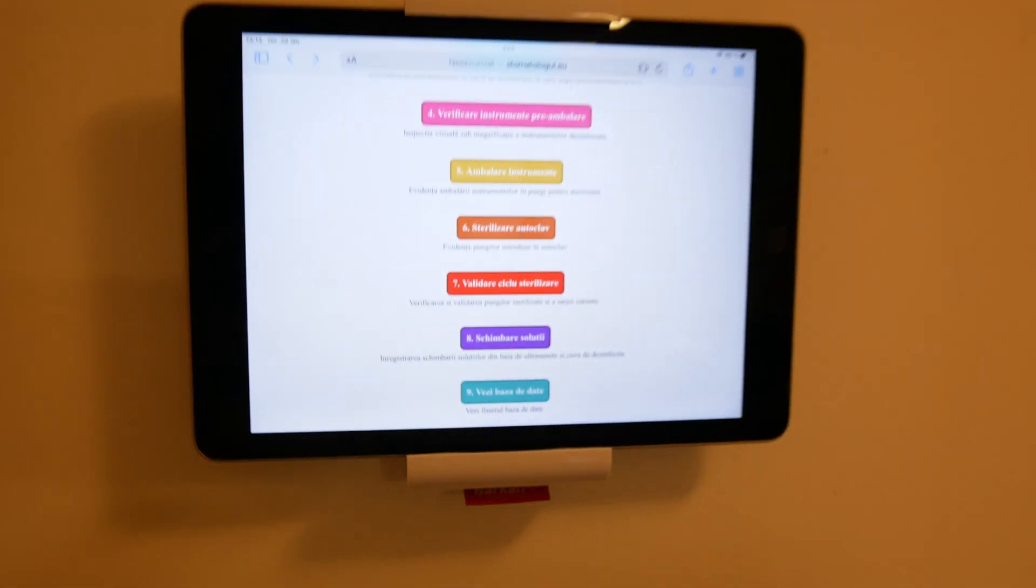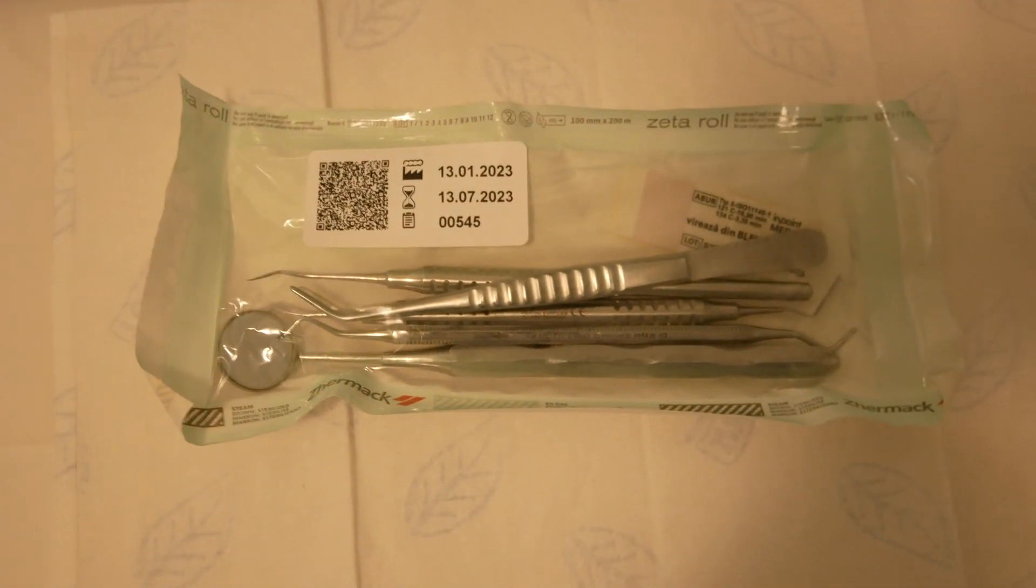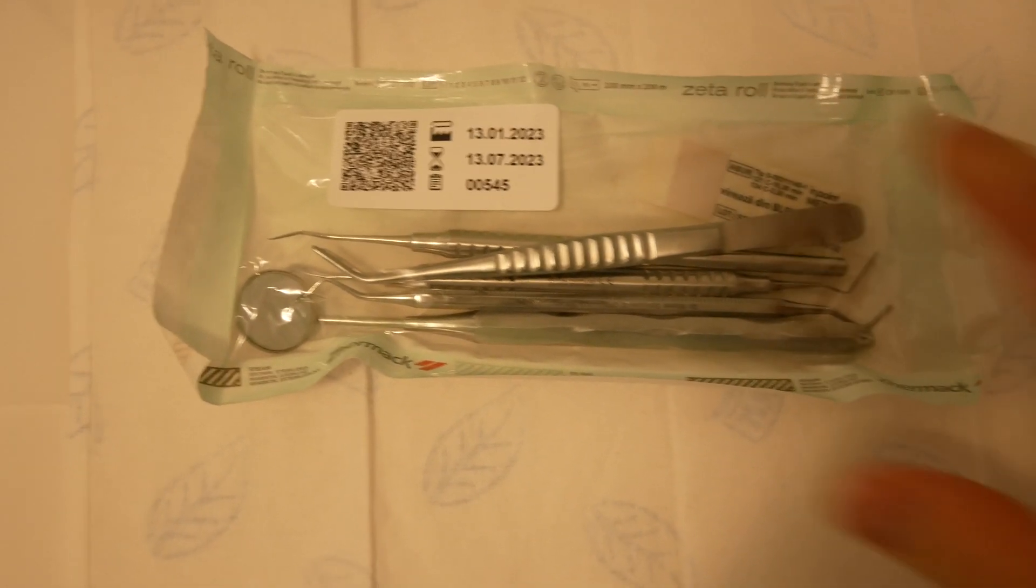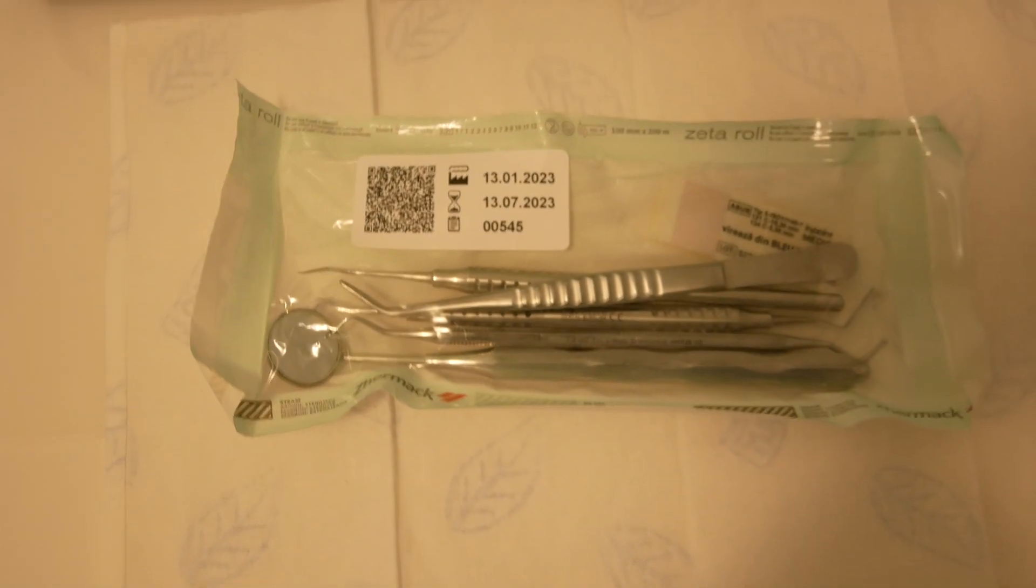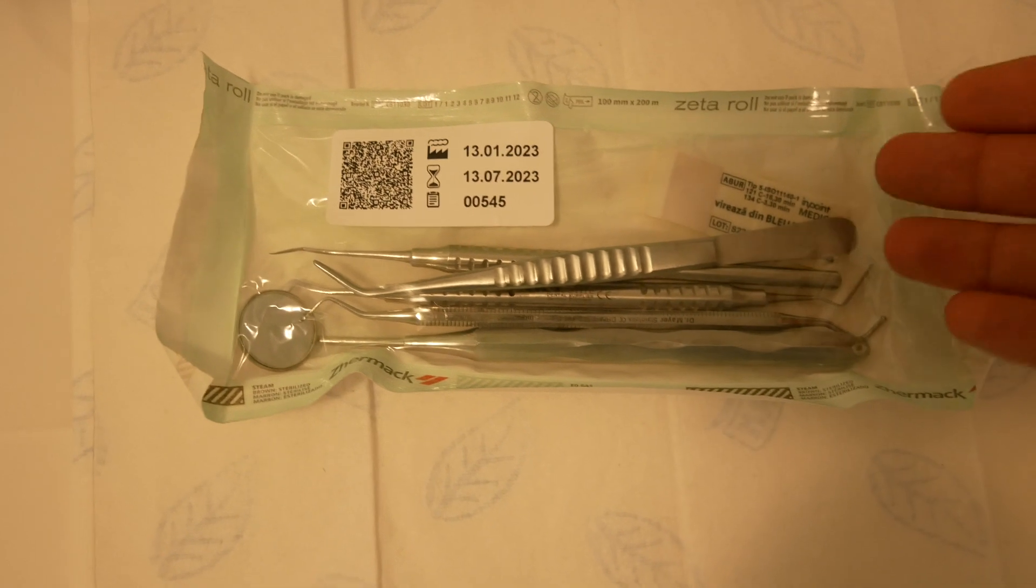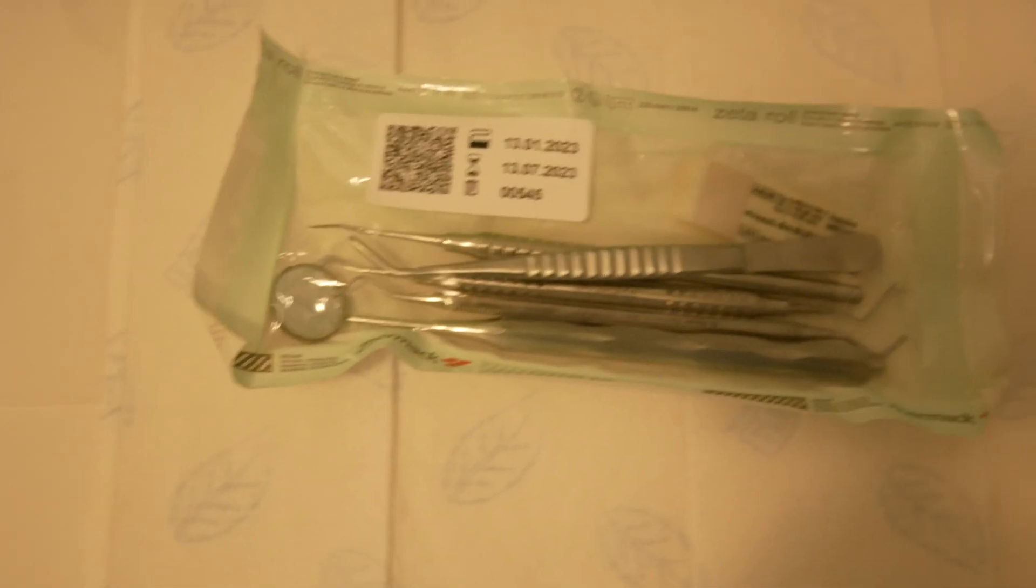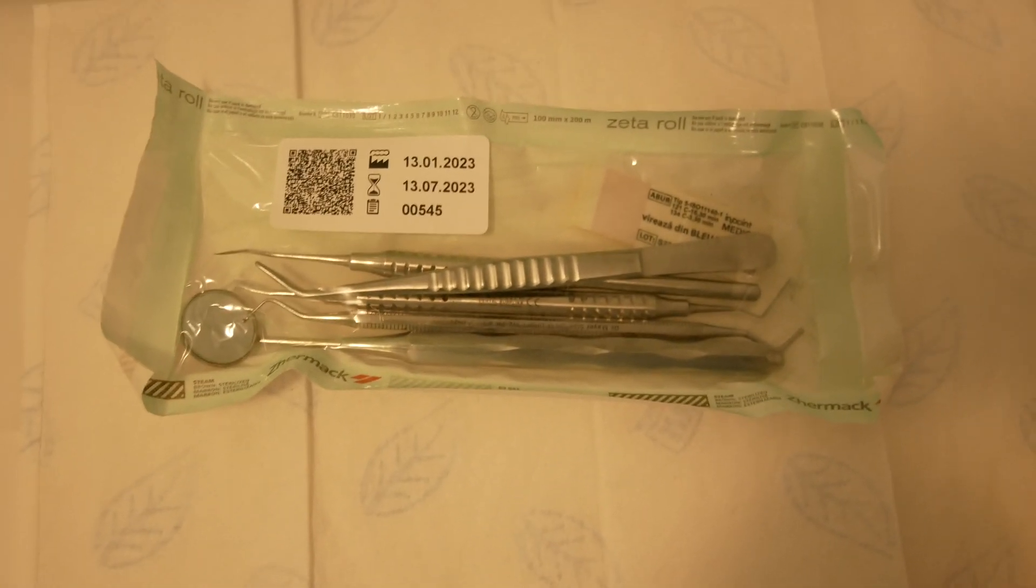And after the sterilization, the packaging should look like this. As you see, the class 5 integrated strip marker has a pink color now. It's changed its color from blue to pink. That means the inside of the bag is sterile.